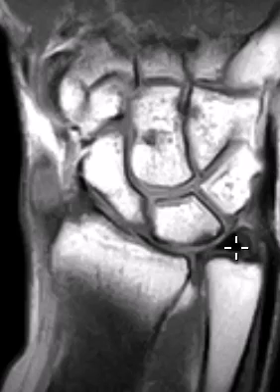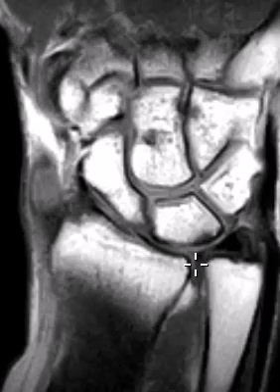With positive ulnar variance, the triangular fibrocartilage is pushed distally and there's not enough room. This patient has prominent thinning of the central portion of the triangular fibrocartilage — the central disc is really, really thin. Maybe the undersurface is partially torn. There's also a little area of darkness in the base of the lunate bone — that dark band is marrow edema. So the triangular fibrocartilage is partially torn or thinned and the ulna is impacting the base of the lunate bone. We call this ulnar abutment syndrome.